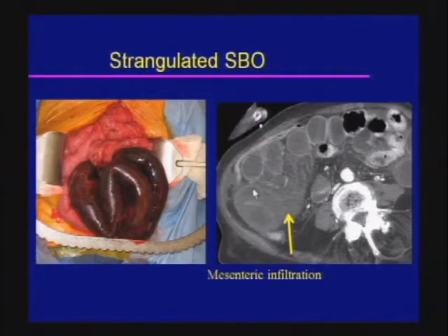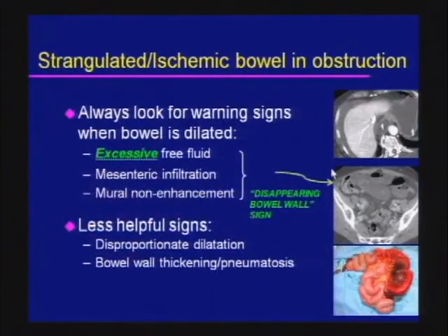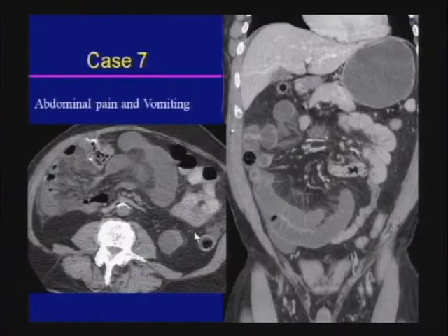The involved bowel loop shows poor enhancement relative to adjacent loops, and there is infiltration into the adjacent mesentery. Signs of strangulation include excessive free fluid — here seen around the liver — mesenteric infiltration, and the disappearing bowel wall sign. Bowel wall thickening and pneumatosis may also be seen, although these are less reliable. Pneumatosis can be seen in many benign causes.